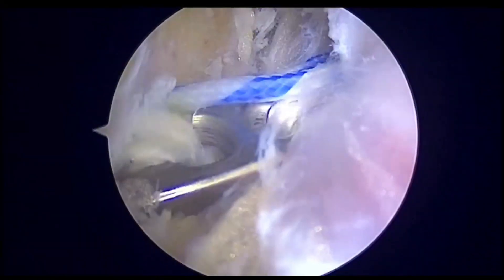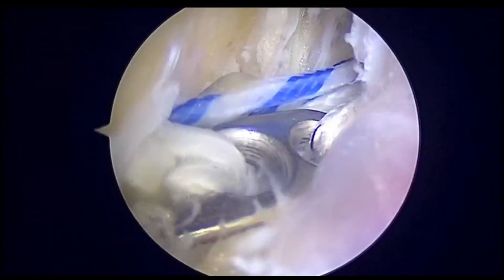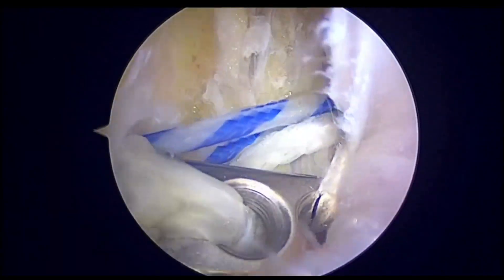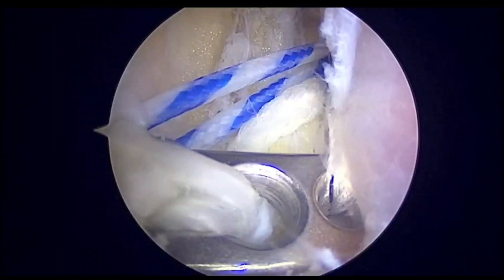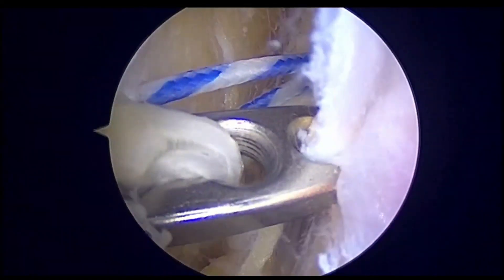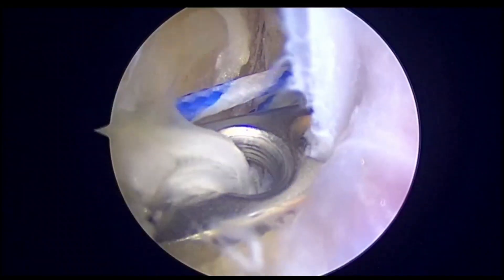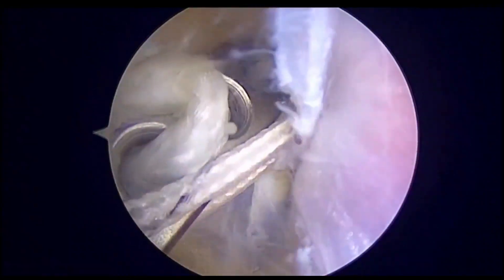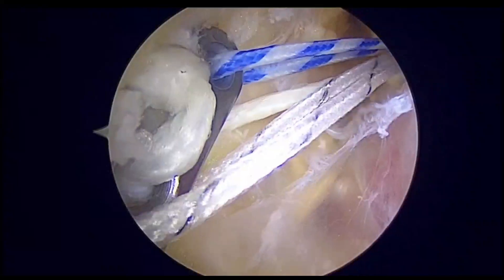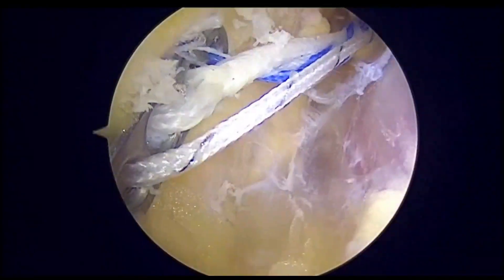We can have the button in vision and ensure the flipping of the button under vision. We can also ascertain the shortening of the loop. The black and white stripe is the loop which pulls it, and the blue one is the one which flips it. The white loop is the loop-shortening loop.